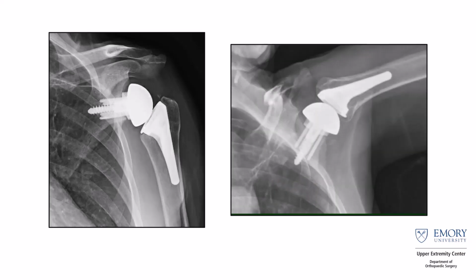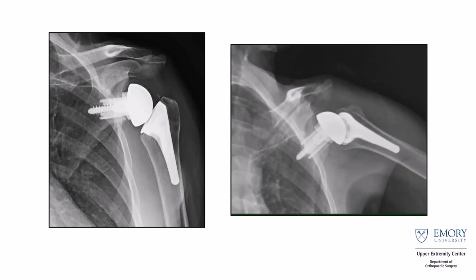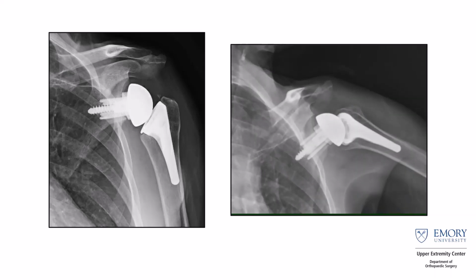So how much is their glenohumeral joint actually moving? How much is their scapulothoracic joint moving? How are they actually rotating? What's happening with the implant? Is there impingement on their acromion? Is there impingement inferiorly in adduction?